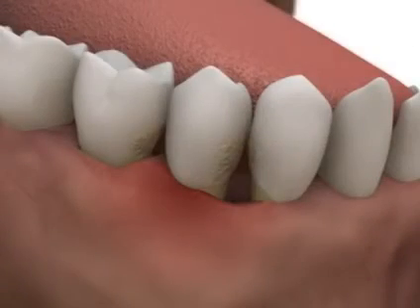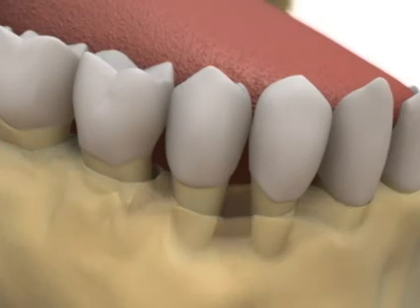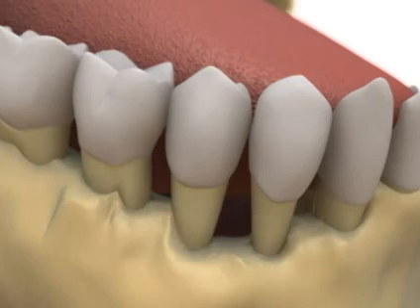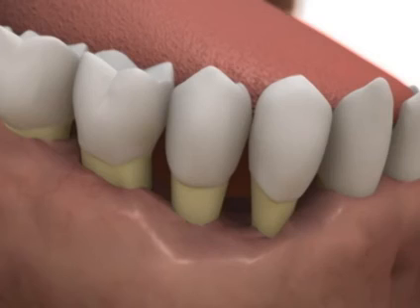When osseous resective surgery is properly applied, it is a highly effective mode of definitive periodontal treatment. Although the very nature of this surgical treatment modality induces loss of attachment, it is a predictable method of achieving reduction of periodontal osseous defects, long-term periodontal stability, and will improve accessibility for optimal oral hygiene and home care practices.